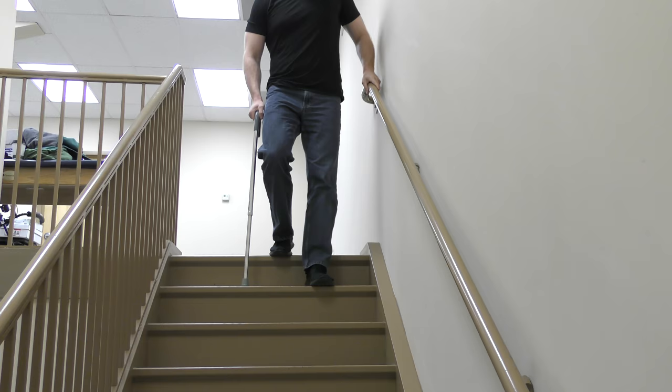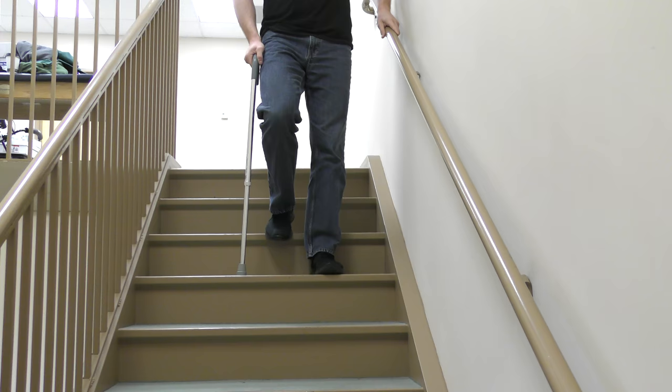When coming down the steps, step down with the involved side and the cane first, then followed by the uninvolved side.